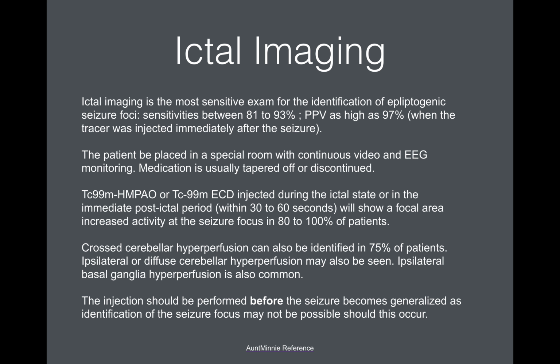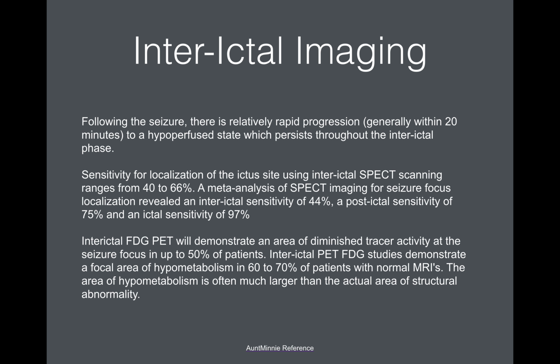Okay, epilepsy imaging. In epilepsy imaging, we perform both ictal and interictal imaging. So again, we most often use Neurolite, and in the immediate post-ictal imaging, the area that's causing an epilepsy shows increased uptake. So again, in the ictal imaging, there is relatively short-lived increased uptake. In the interictal imaging, the same area should show decreased uptake. Now, ictal imaging is superior to interictal imaging, but ideally we will use both.